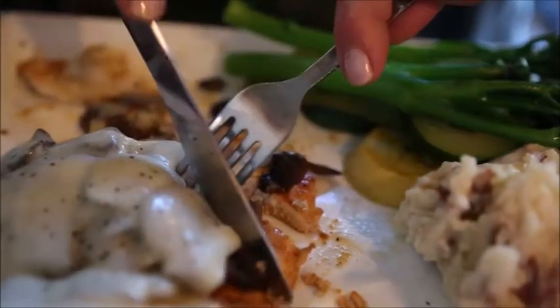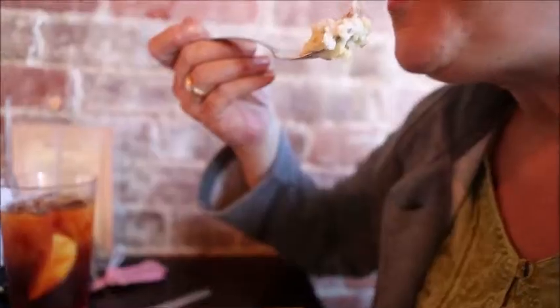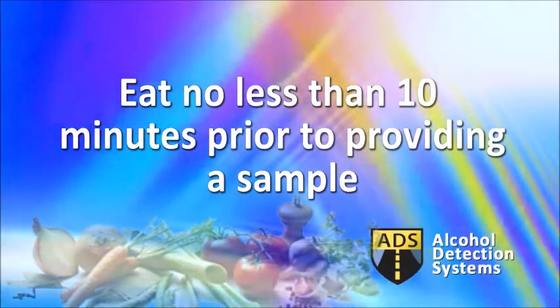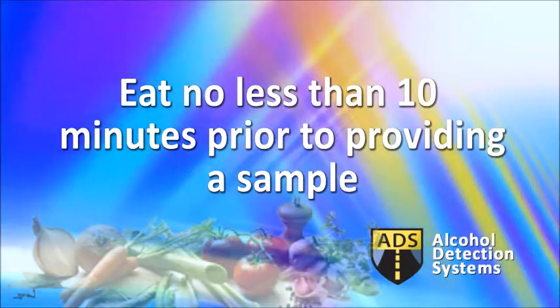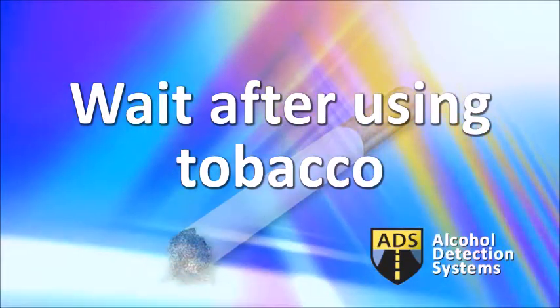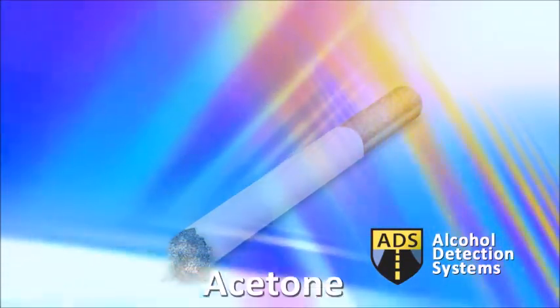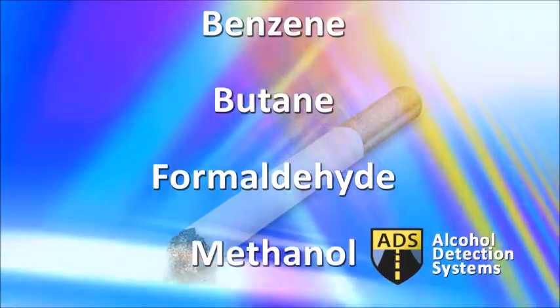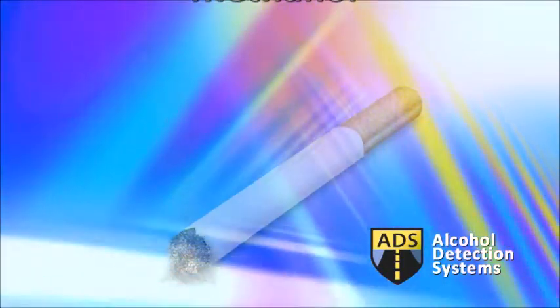While most foods do not contain alcohol, when combined with other chemicals in your body, they may produce a natural alcohol effect. It is recommended you wait 10 minutes after eating or drinking prior to providing a sample. Wait after using tobacco. Tobacco contains hundreds of various chemicals, and exposing the device to these pollutants may cause your device to cease functioning properly.